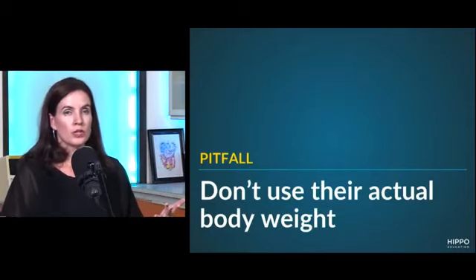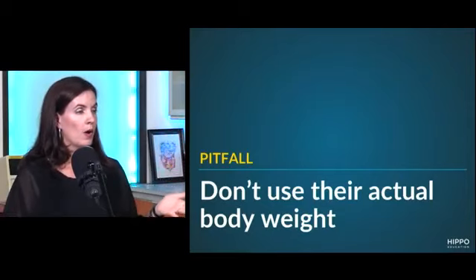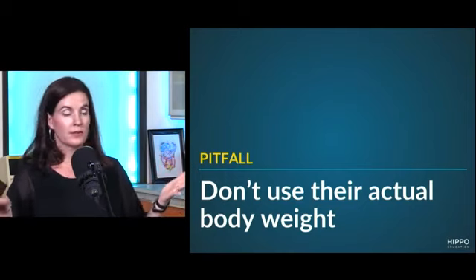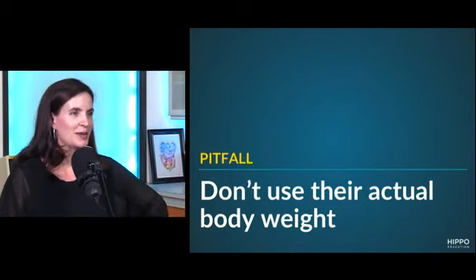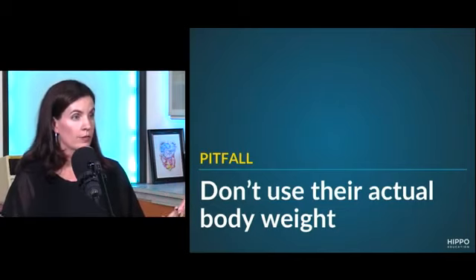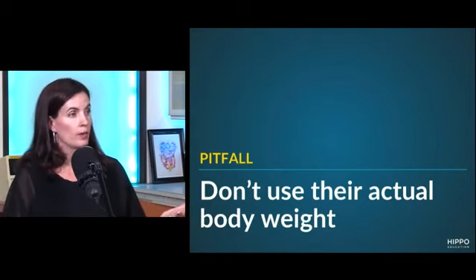That's because our lungs don't get fat. True. So you want to use their predicted or ideal body weight to give you a decent size number. To give you an impression of that, say we're ventilating Paul. I'm going to say Paul's 70 kilos. I don't know what he really weighs, but that might be his 68. Pretty close. 68 makes the math really hard for me, so could I go with 70? Yes, absolutely. So I'm going 6 cc's per kilo. His tidal volume is going to be around 420 cc's in each breath, and that would be a reasonable starting ballpark for the average 70 kilo person.